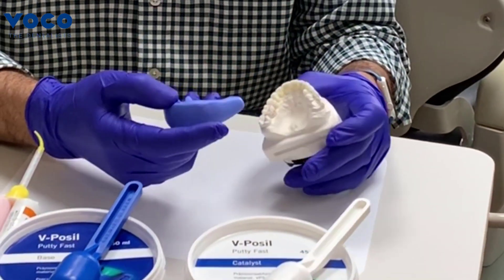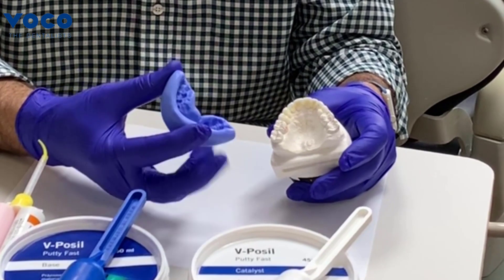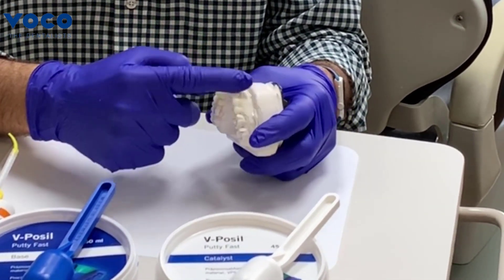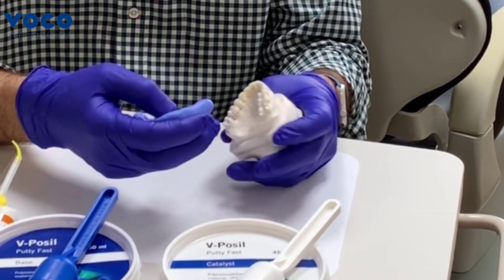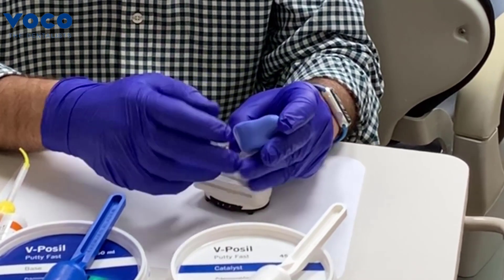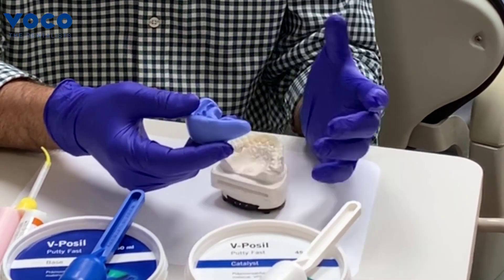We've gone ahead and separated our putty matrix from our diagnostic wax-up. Remember we placed KY Jelly on here, so some of it would have filled in. Make sure you clean this off really well — which we've already done — and make sure it's really dry.